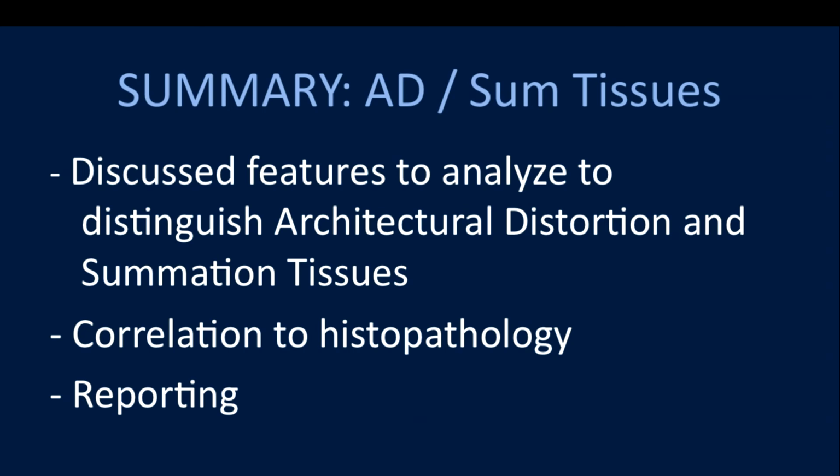So when they come back, even a month later, because they had a big hematoma and we couldn't do the post-mammo, they have so much distortion, it looks much worse than what you start with, and those are very hard to follow, I think. Yeah, that's a good point. We debate that too, actually, in our group, that it can be very hard to follow distortion after benign, especially when they're large. Because if you have a 2-centimeter area of distortion, how do you know if it's partly changing? So we debate that too.